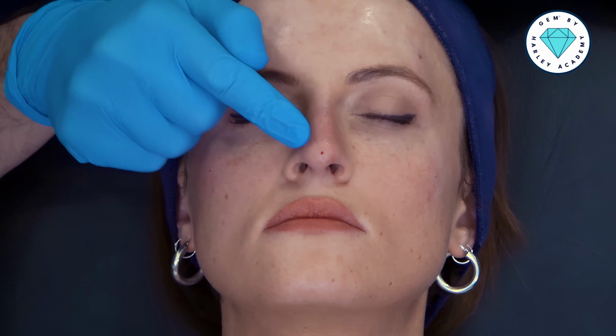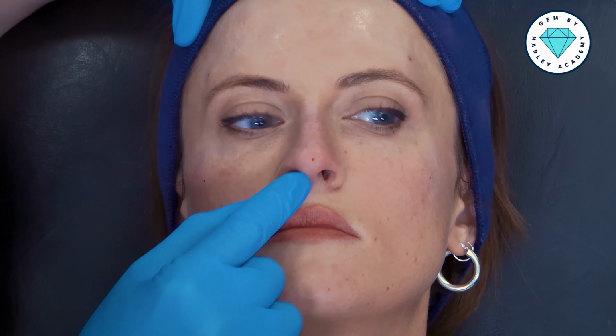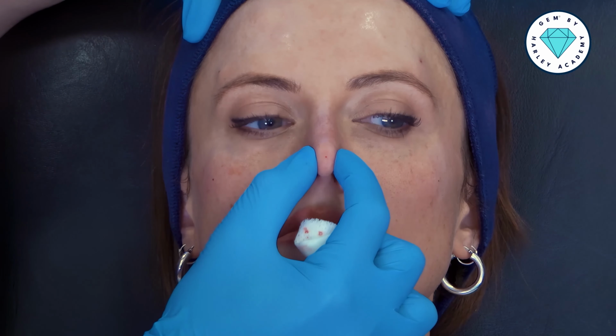We have to assess capillary refill at the end of any nose treatment. So in particular, I'm looking at the tip of the nose. Very fast, less than 1 second capillary refill. No skin discoloration. Any severe pain? Nope. And importantly, pinprick bleeding at the tip of the nose. Bleeding is good, okay? In the case of a vascular event in the nose, we may not see any bleeding where our cannula entry point or our needle is. So bleeding is a reassuring sign at the end of our nose treatments.